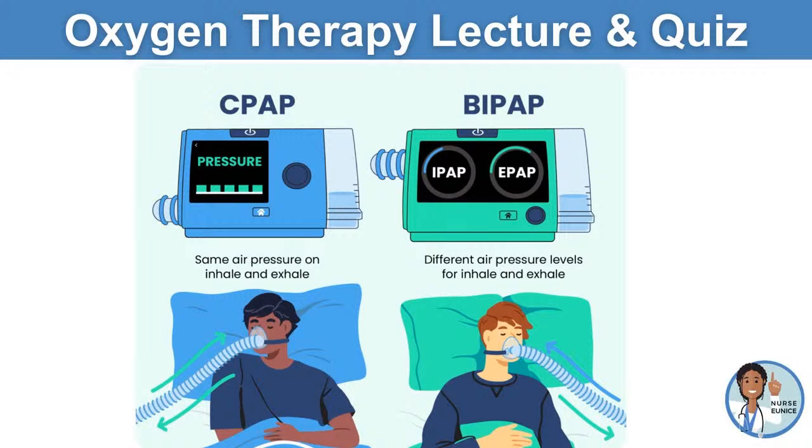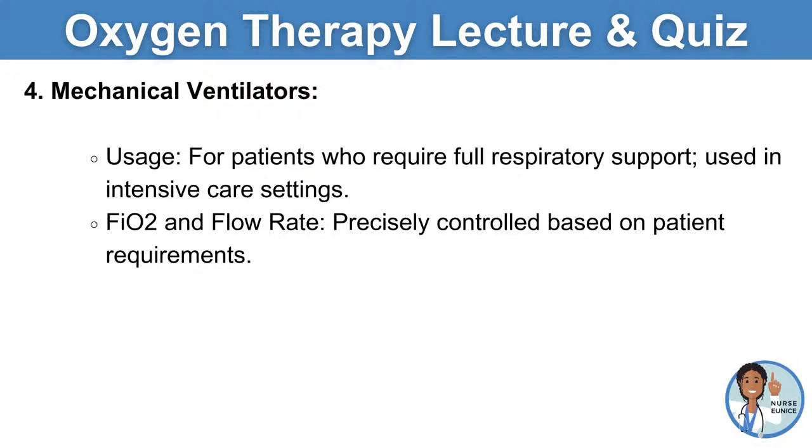When you see a patient with a mask that they have to put on at bedtime, it could be the CPAP or the BiPAP. If you're in home care or in a nursing home type facility, your job is to make sure the patient has it on at night. In the hospital, sometimes we have respiratory therapists who will assist us. If the respiratory therapist isn't there, then of course it would be your job to help assist the patient with their CPAP and their BiPAP.